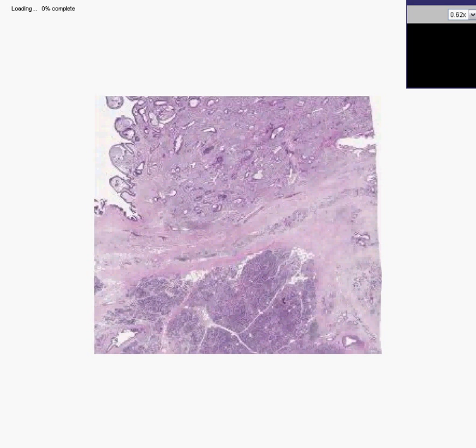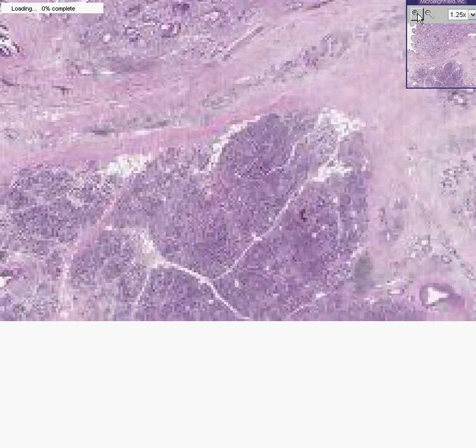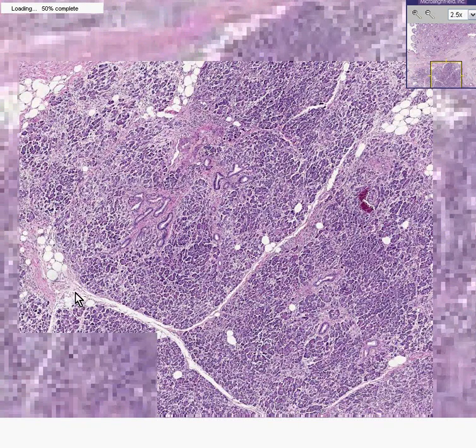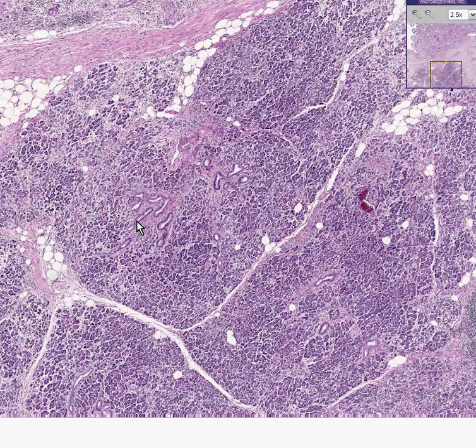in which we can see, if we perhaps move down or move up and zoom up to this area, I will have no trouble convincing you that these are generally nice lobules of the pancreas. Here are some intralobular ducts. Here are the actual lobules. Here's a group of acini. There might be an area here that is a little more fibrotic than usual. There's no cancer at all within this part of the pancreas.